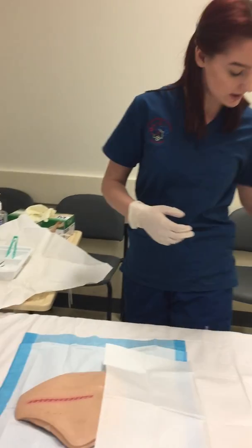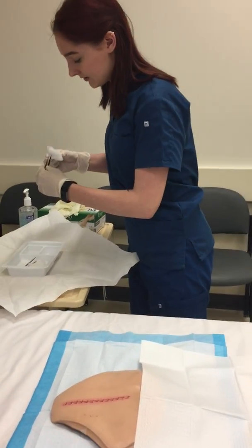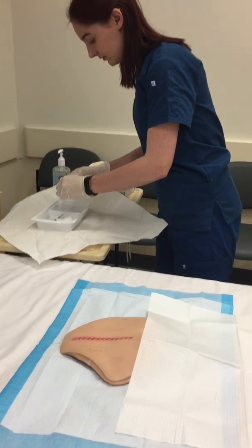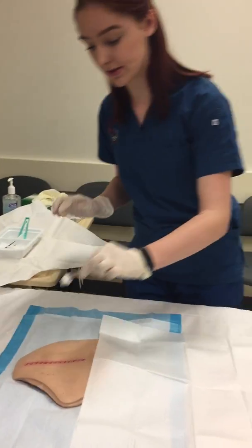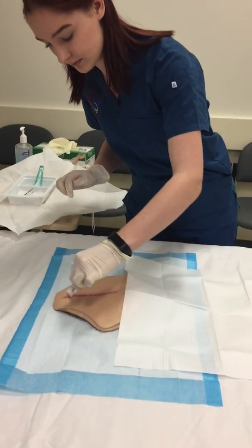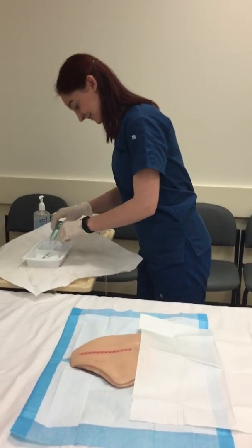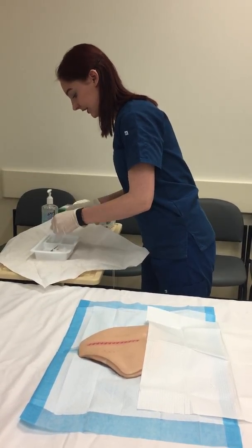And then this is now contaminated, so I'm going to throw it out. I'm going to take another, soak it. And then I'm going to go along the edges. So I'm going to go along this edge first. Throw this out. And I'm going to do one more for the other edge there.